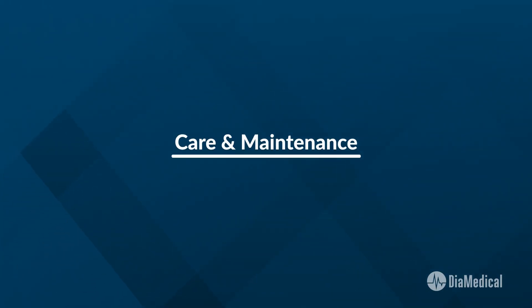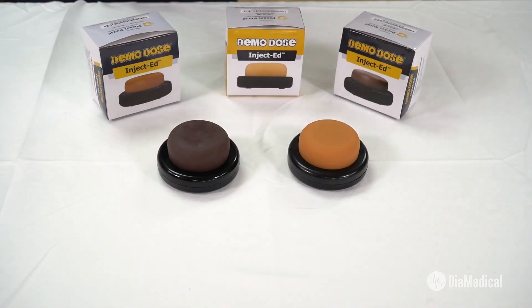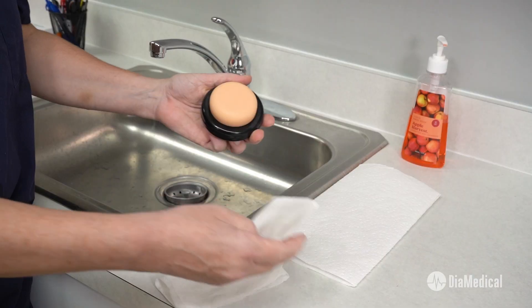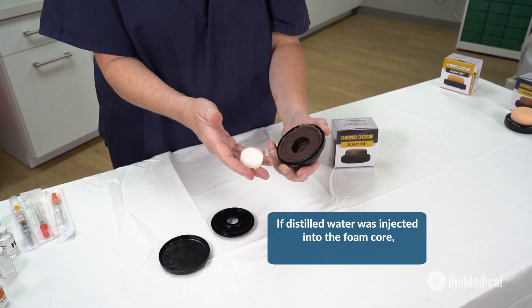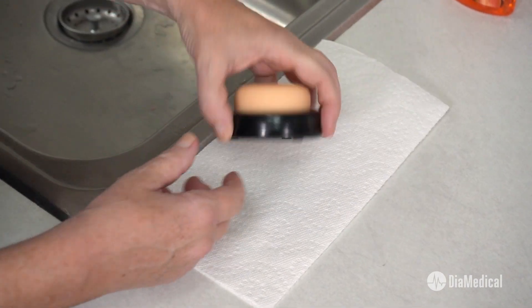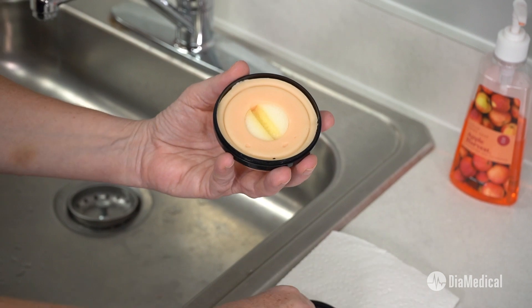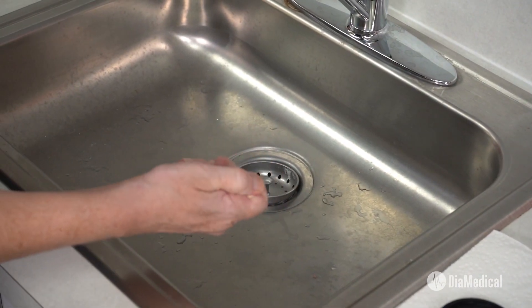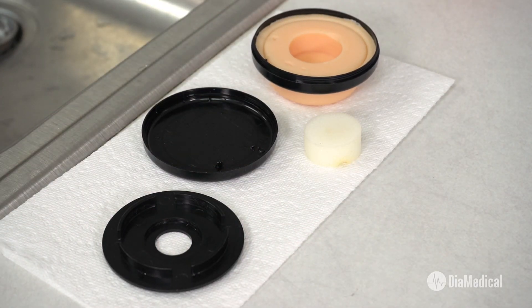A few simple steps will help the Inject-Ed provide practice opportunities for as many students as possible. Start by wiping the skin surface with mild soap and water, rinse well, and let it air dry. If distilled water was injected into the foam core, it must dry completely afterward. Twist the base clockwise to open the Inject-Ed, then gently detach the base ring from the foam. Squeeze all the water out of the foam and let it air dry. The foam can also be cleaned with mild soap and water if needed.